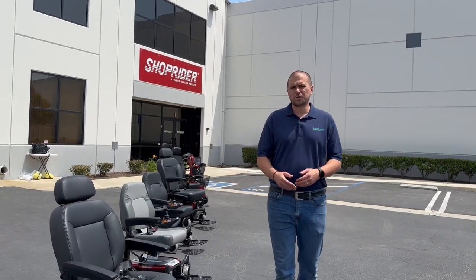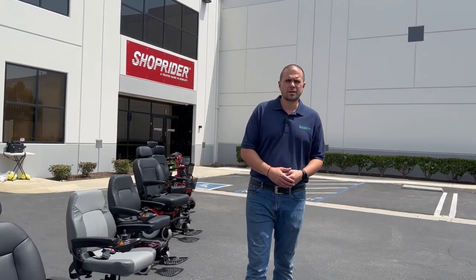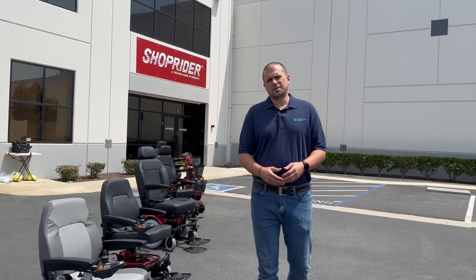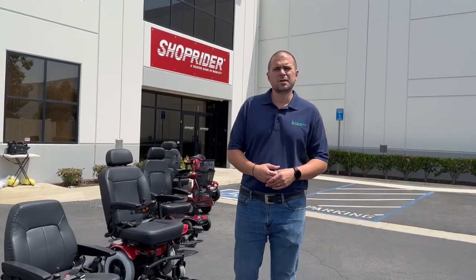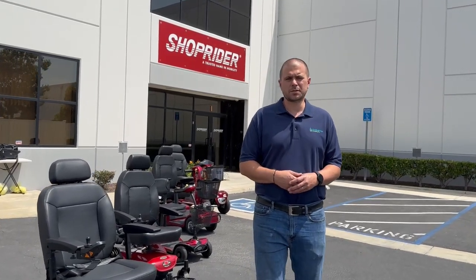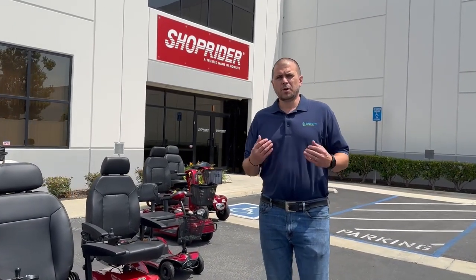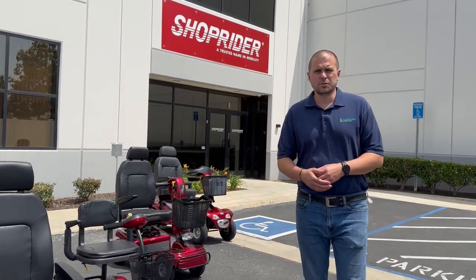ShopRider offers some power wheelchairs that are mid-wheel drive. They have some portable power wheelchairs that break down into pieces. They have some heavy-duty power wheelchairs, portable mobility scooters, mid-sized mobility scooters, and heavy-duty mobility scooters. So in the next few videos, we're going to show you more about their products. Let's get into it.